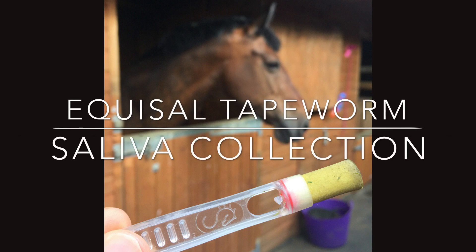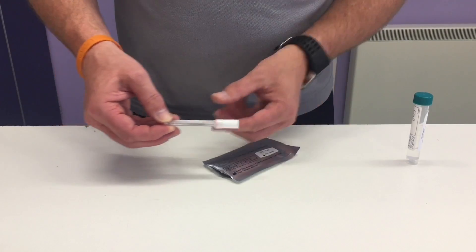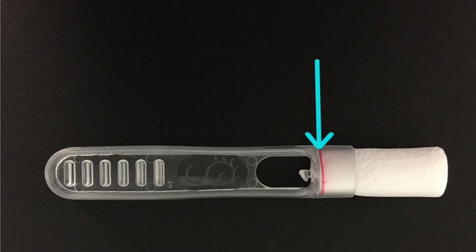In this video we show you how to collect a horse's saliva sample using the new version of the Equicel swab. The saliva collection swab has a ridged handle, an absorbent end to place in the mouth, and a red line is visible on one end which is part of the colour change indicator.